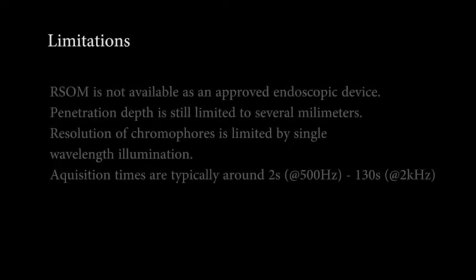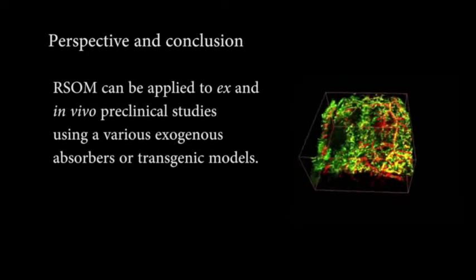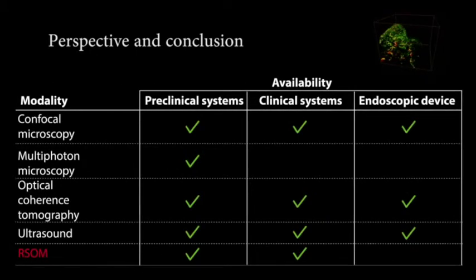This technology is not available as an approved endoscopic device. Current research systems are limited by penetration depth, single wavelength illumination, and acquisition times. However, despite limitations, it holds great perspective for preclinical applications in the future. And it might play a role in gastrointestinal imaging if the technology could be implemented into an endoscopic device. For RSOM, it has not been achieved yet.